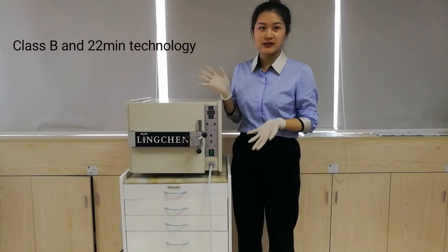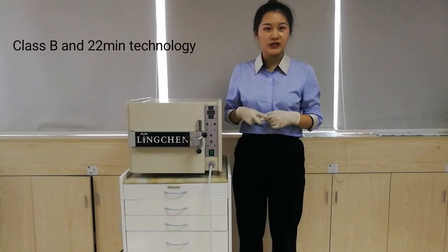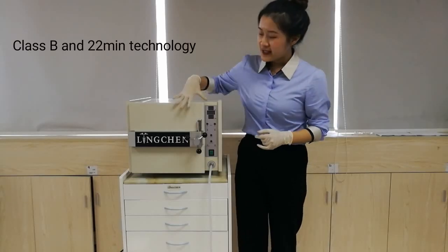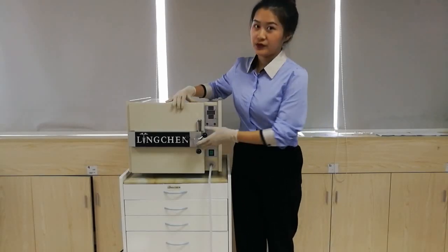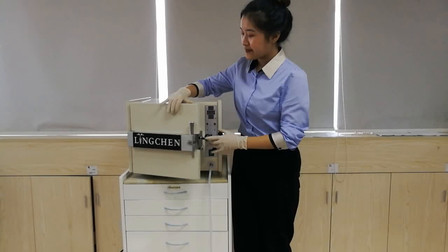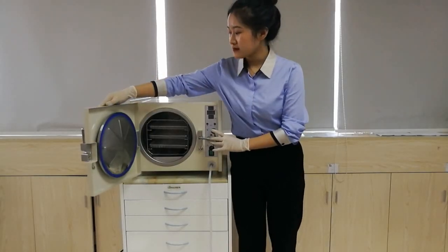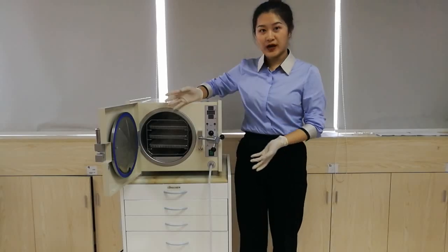Hello, I'm Jennifer from Lingchen Dental. Today I share with you our new autoclave, which is Class B function and takes 22 minutes to finish the sterilization. We made the door more beautiful and it's 18 liters. Now let me show you how to use it.